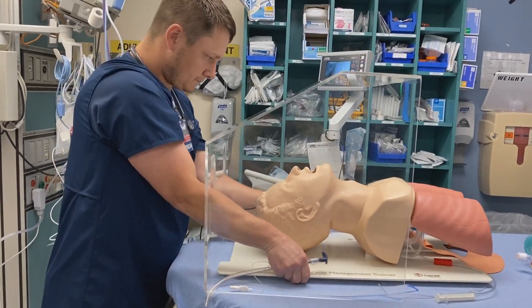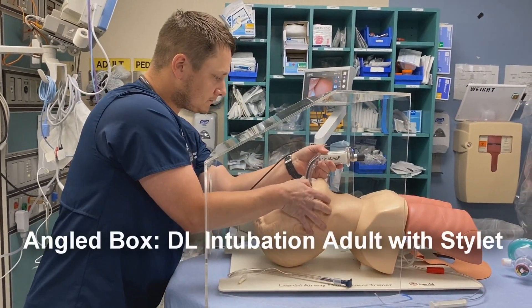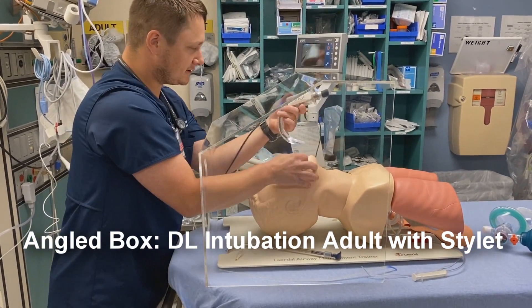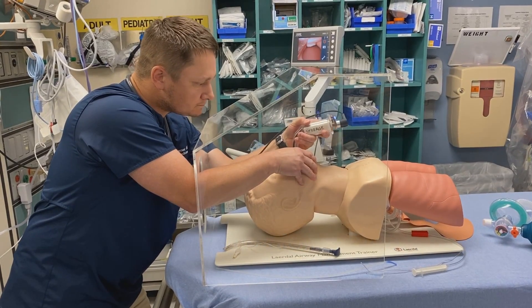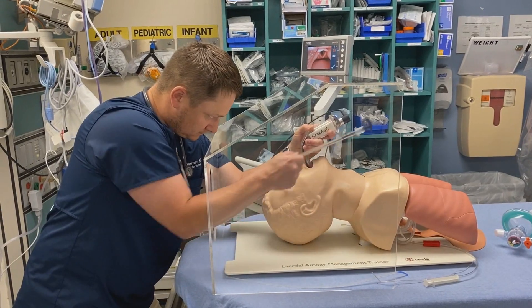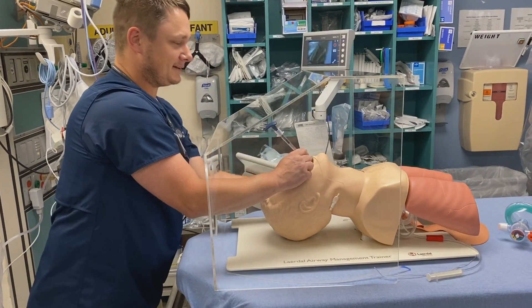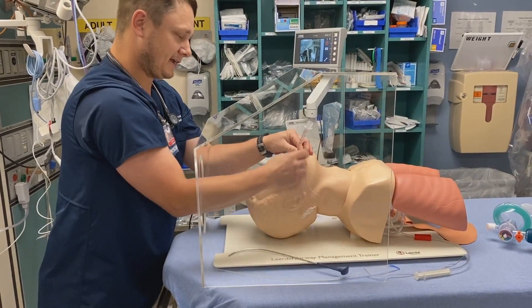So I would still be at greater ease with it. Now I want you to do this without looking at the screen — just a plain DL, direct laryngoscopy. I think I can definitely do it.